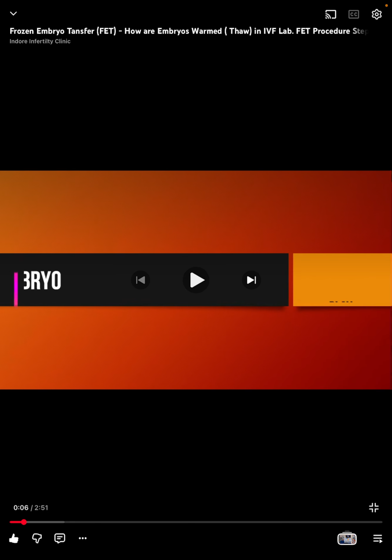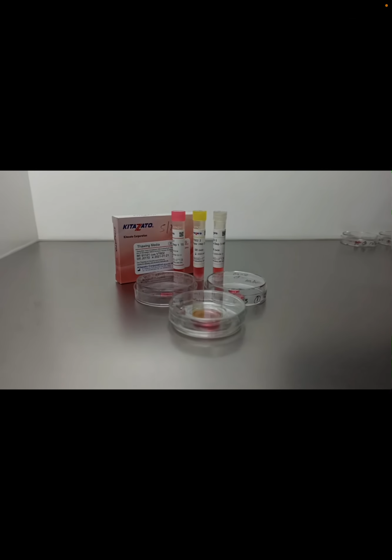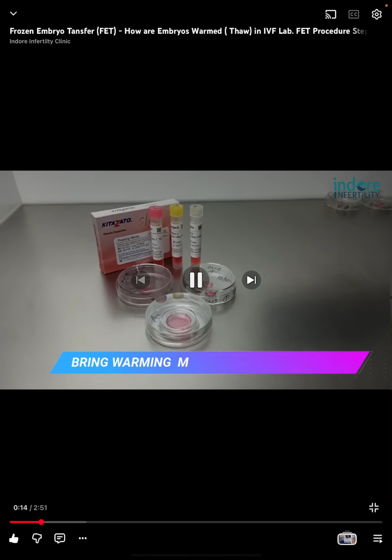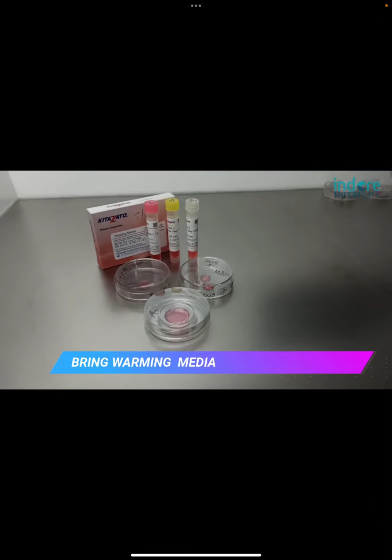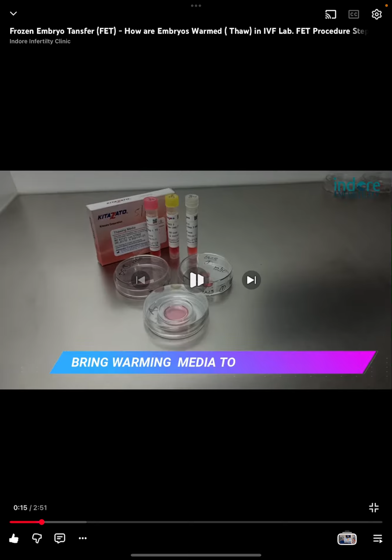In this video, they properly explained what the embryos are and all. Very properly. Just see this video. So if you notice, this is a central well dish. Okay, this is a warming media being used for embryos.